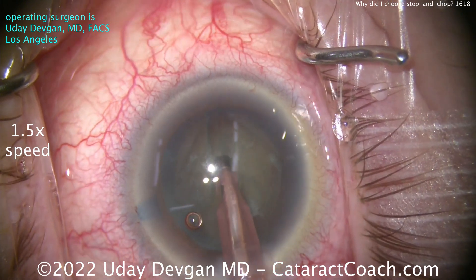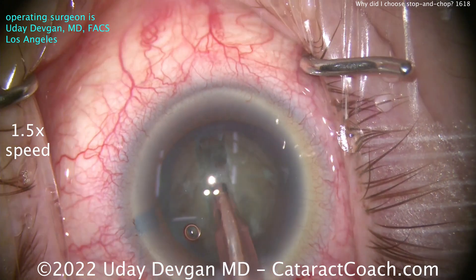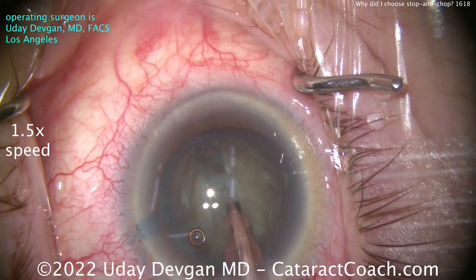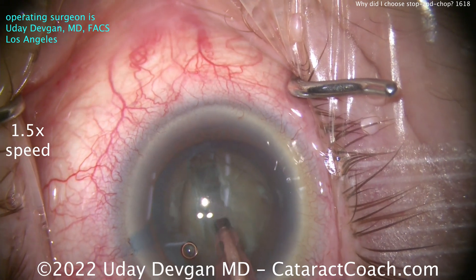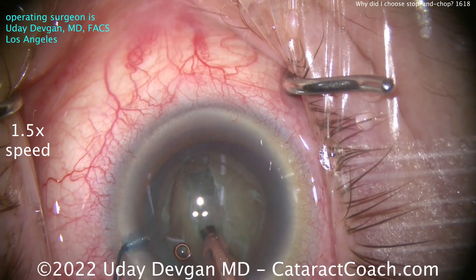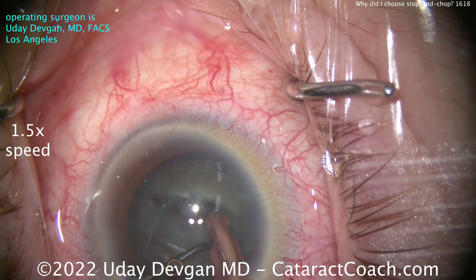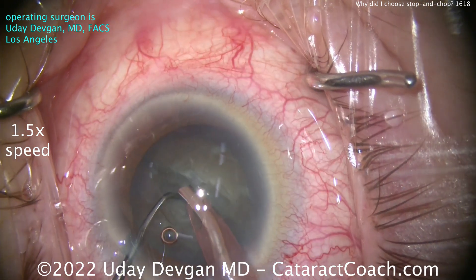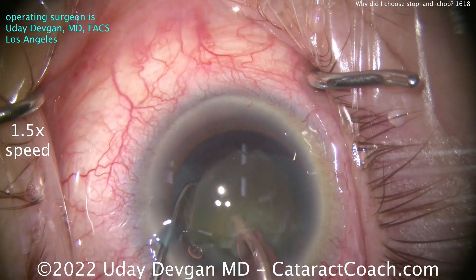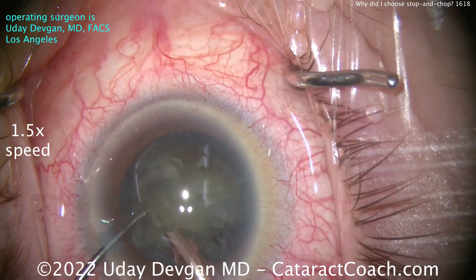When I do this groove down the middle for stop and chop, we're debulking the nucleus. Notice how I make the groove — that sculpted groove is about one and a half phaco tips wide. I'm really getting a nice wide debulking of that central densest part of the nucleus. The densest part is that central endonucleus, and we're emulsifying and debulking it. So now when I split the nucleus, each half is less than 50%. Assume the groove took out about 20% of the lens volume — now each half is only about 40%. Now I can buzz into that half, bring it up and chop it, and here at the iris plane take out little pieces at a time.